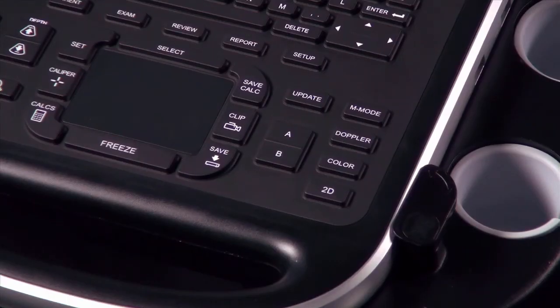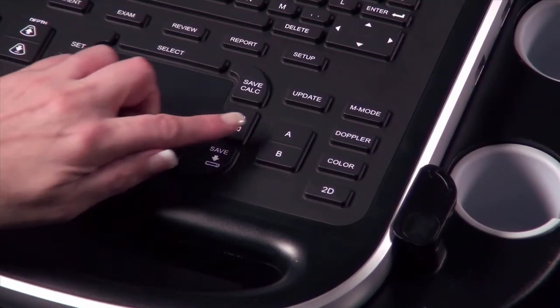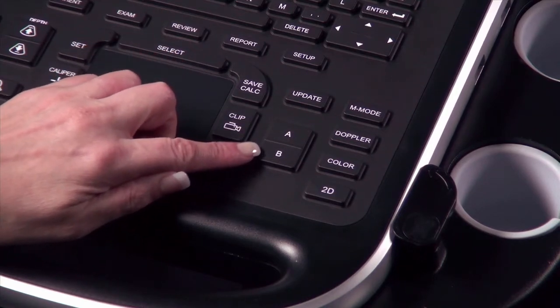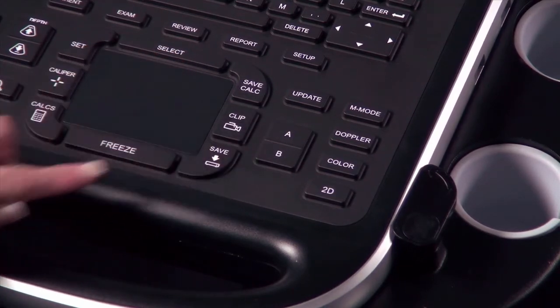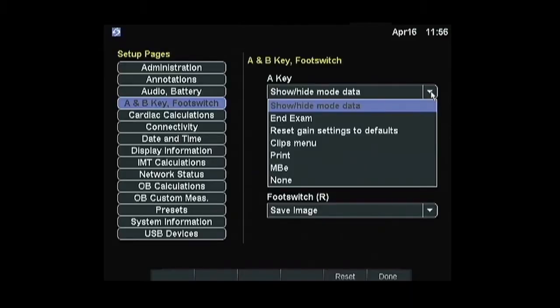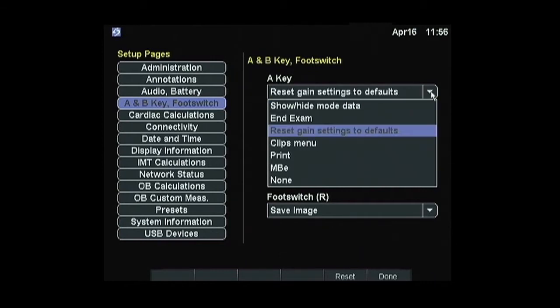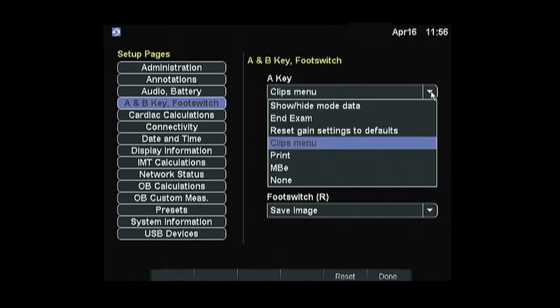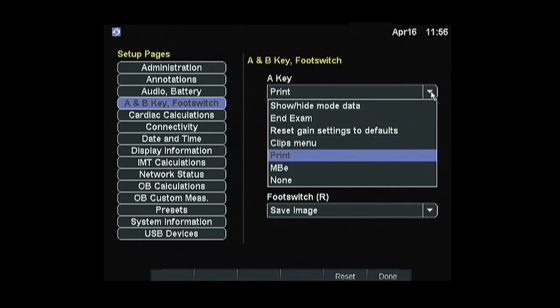Off to the right side of the touchpad are two shortcut or programmable keys, A and B. You may choose a function for each of these keys in the setup menu to create the shortcut you desire. Other assignable functions include show or hide mode data, end exam, reset gain setting to defaults, clips menu, print, MBE, and none.